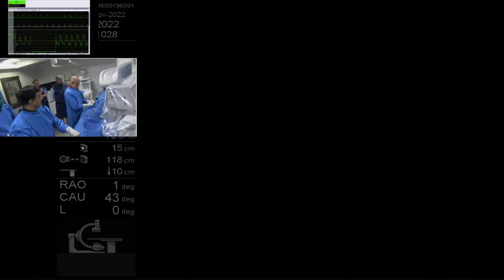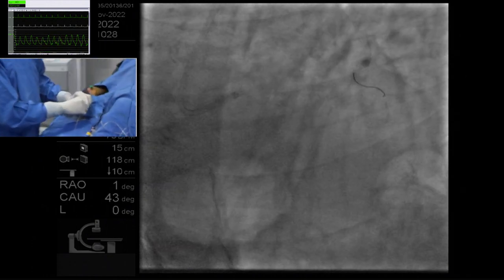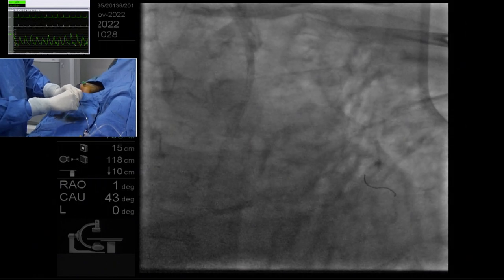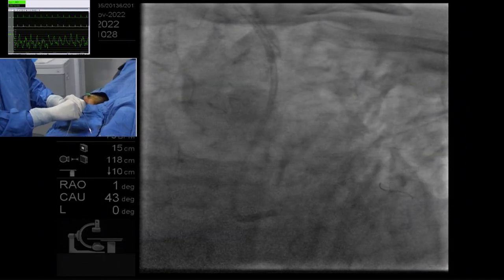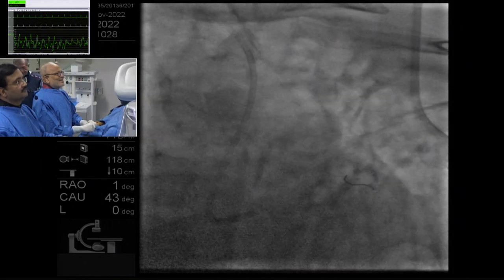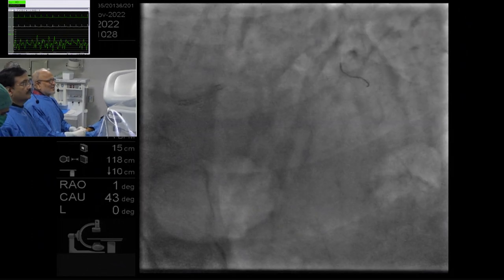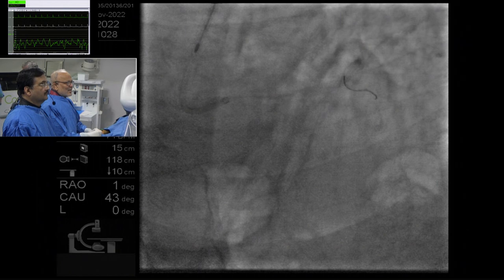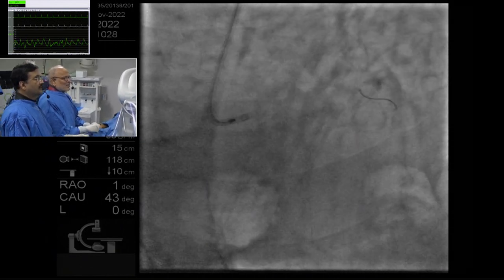So you don't want any hiccup when you do. Have you tried advancing with DynaGlide, releasing the brake and just going by DynaGlide, the wire? DynaGlide while coming back I always apply. Yeah, while going I don't know why. No, but going in, you can release the brake. You can. And then you can do it like a single operator. Correct. Because the wire doesn't move. Correct. Yeah, we do that. I mean, going in, going out, we always use Dyna. You don't even have to hold the wire.